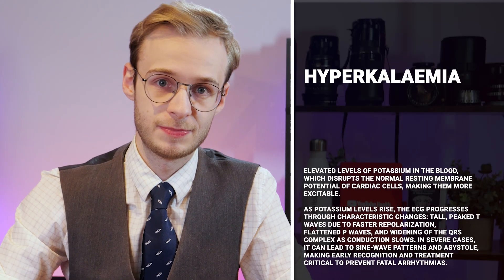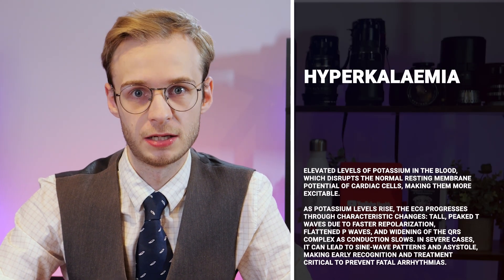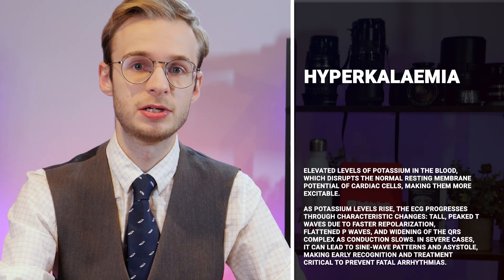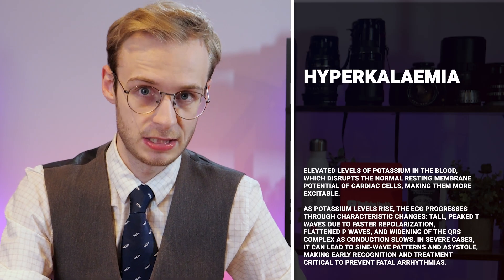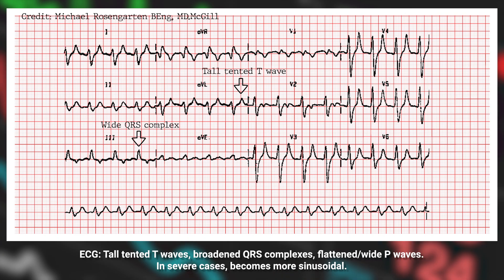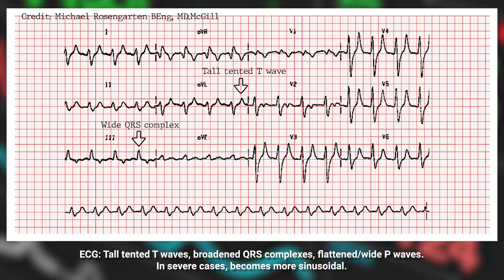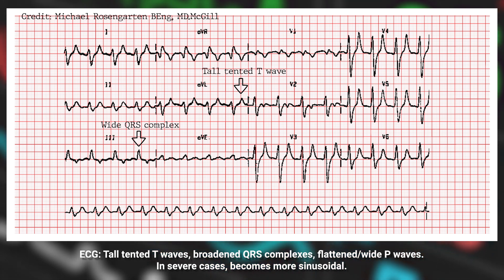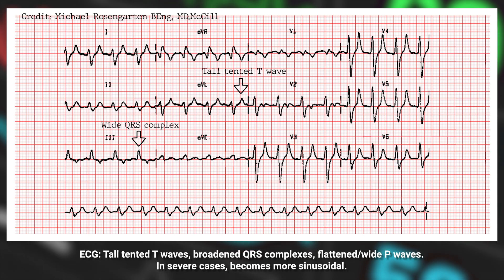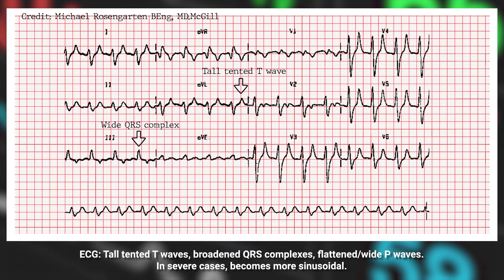Moving on to electrolyte disturbances. Hyperkalemia — very high levels of potassium — disrupts the cell's resting potential and makes cells more excitable. As potassium rises, the ECG goes through characteristic changes: classic tall tented T waves due to faster repolarisation, flattened P waves, and widened QRS complexes as conduction slows. In the most severe cases it leads to a sinusoidal pattern and potentially complete asystole. In severe hyperkalemia, rapid recognition and treatment are essential to avoid fatal arrhythmia.